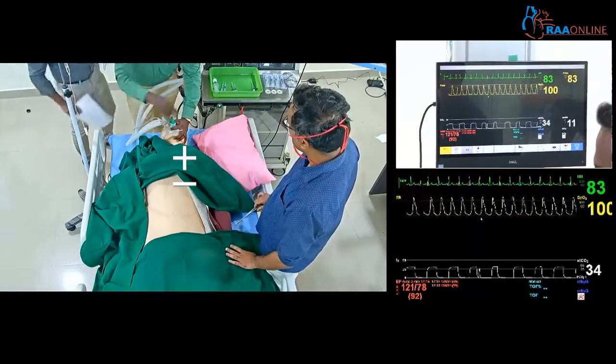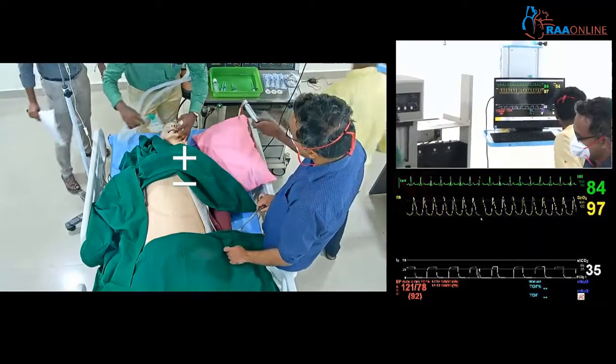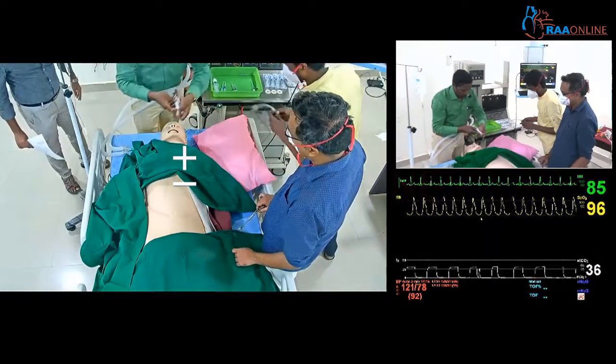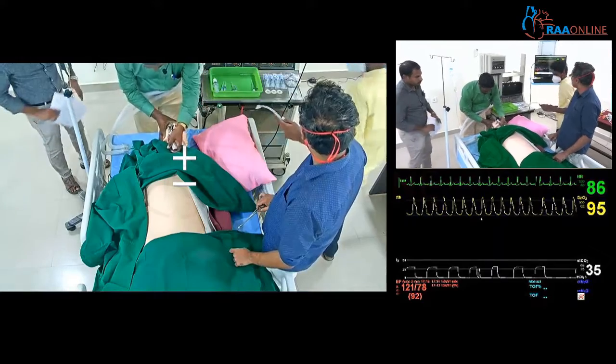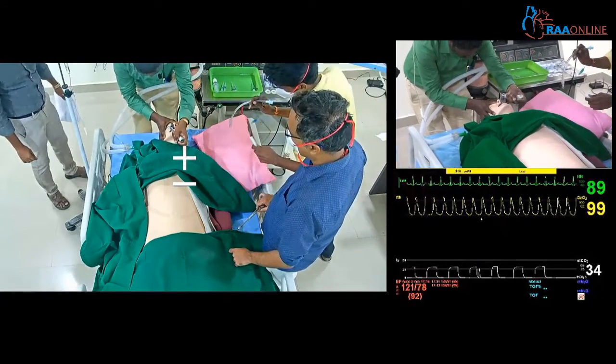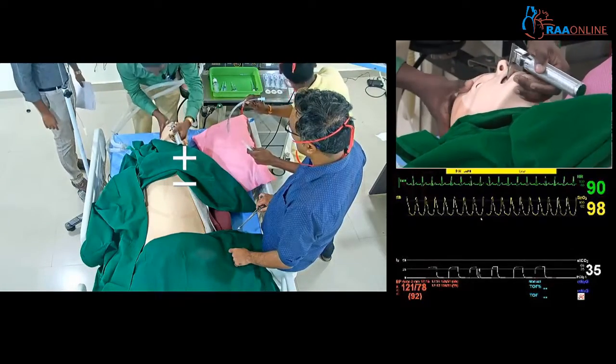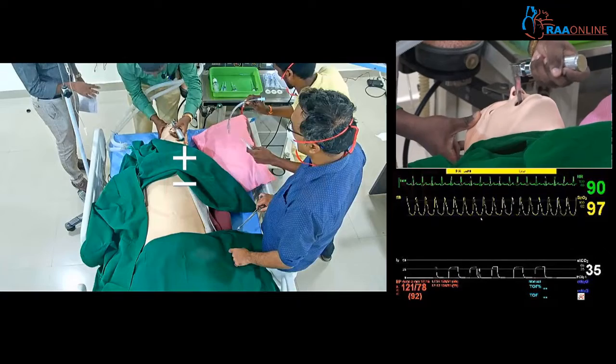Okay, sir. Get the laryngoscope and give an 8.5 size tube. Have you positioned the patient properly? Right. Okay. The patient is not properly positioned.